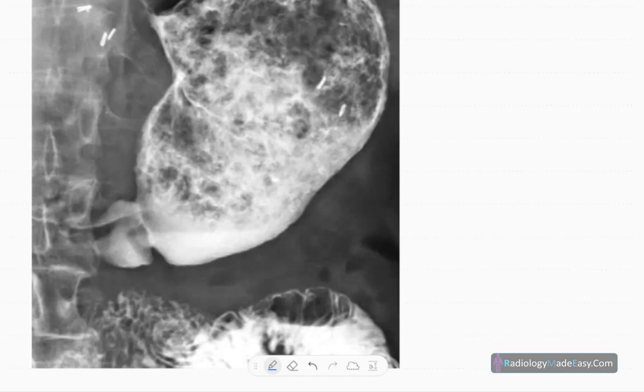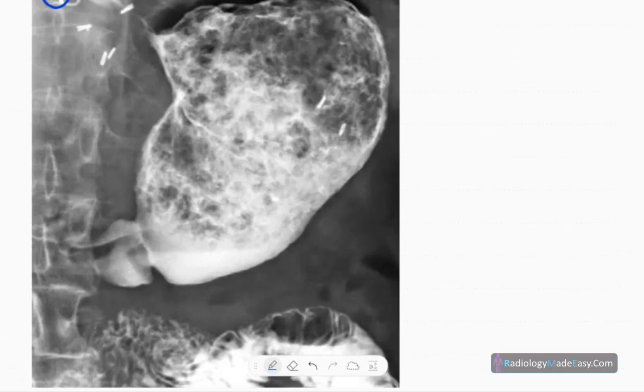You can see the distended stomach here. The stomach is normal in position, however is distended. You don't see the regular rugae pattern, so rugae pattern is absent and you can see a mottled appearance.